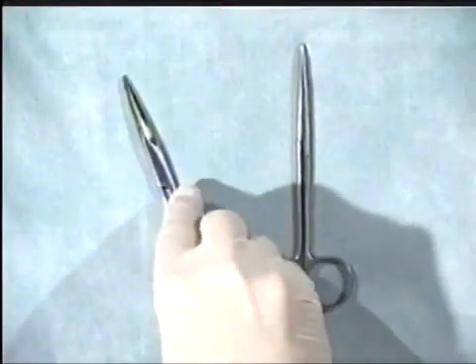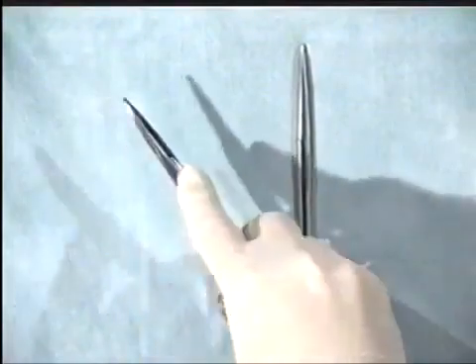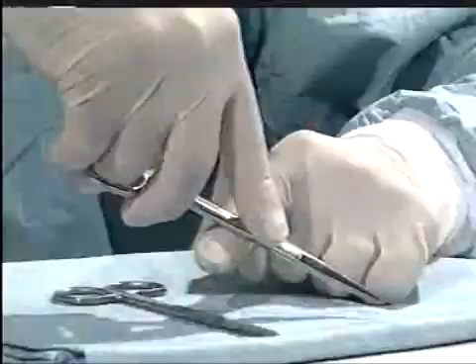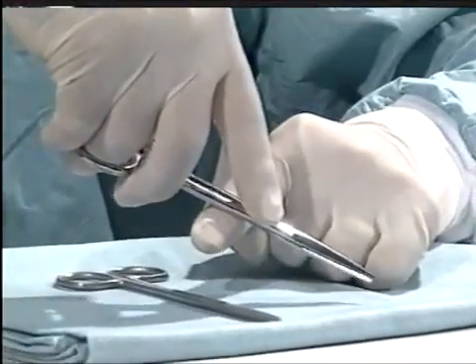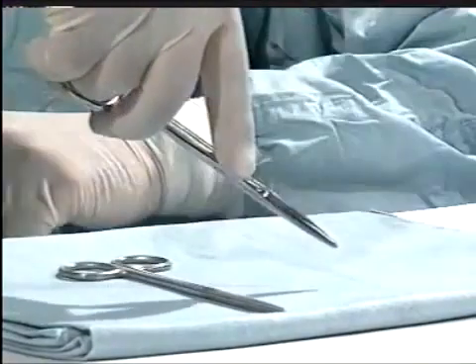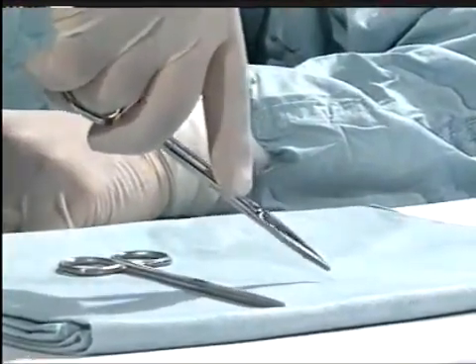If you're cutting sutures at depth, such as in the pelvis, it's often wise to stabilize the instrument over your index finger. This allows for accurate cutting and prevents a tremor down a deep dark hole.